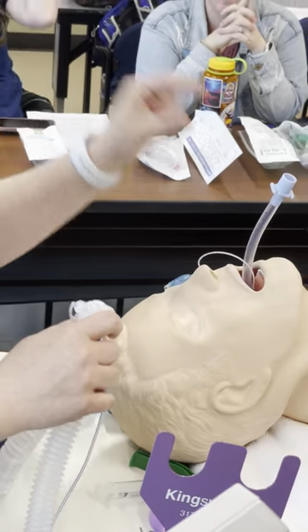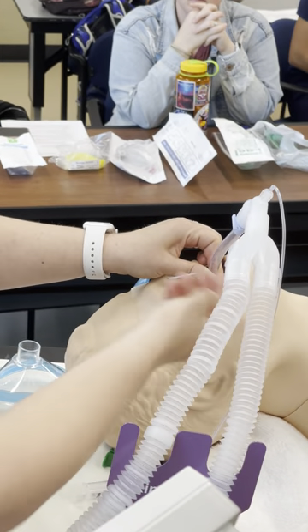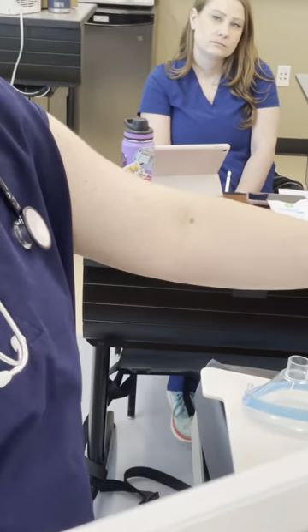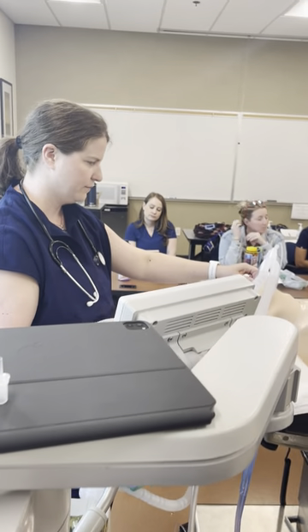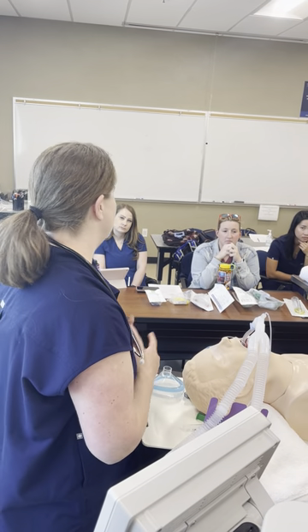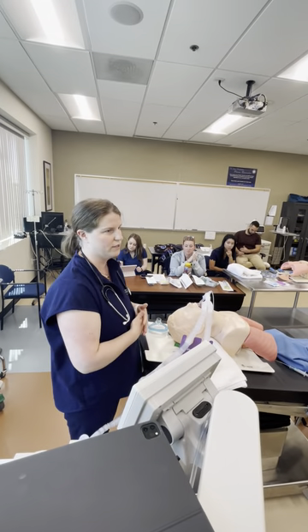When connecting the circuit, grab the ET tube, pinch it with your fingers, hold it at the lip, and connect the circuit — rest it there so the circuit weight isn't pulling on the patient's trachea. Squeeze the bag and look for chest rise and fogging in the tube, then turn to confirm end-tidal CO2. Squeeze at least five or six times to confirm continuous CO2, because if you accidentally insufflated the stomach or esophageally intubated, the first two breaths may give small blips of CO2.